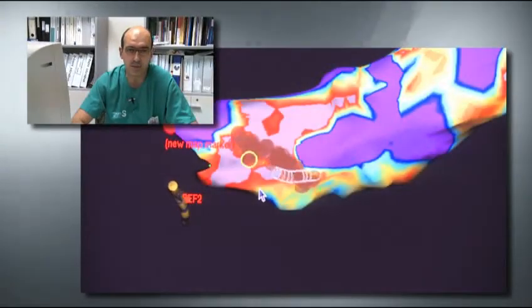cuando los episodios de taquicardia ventricular se hacen muy frecuentes y el paciente sufre muchas descargas, está indicada la realización de una ablación del sustrato de la taquicardia ventricular.